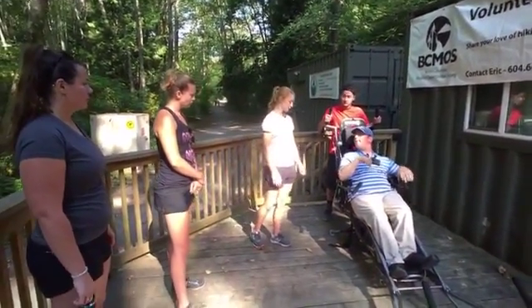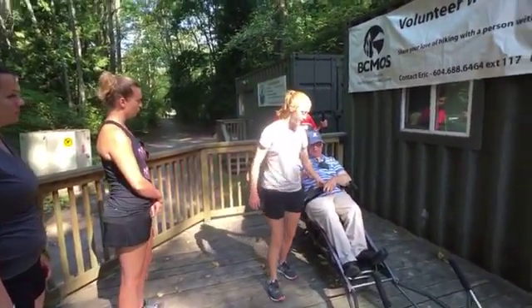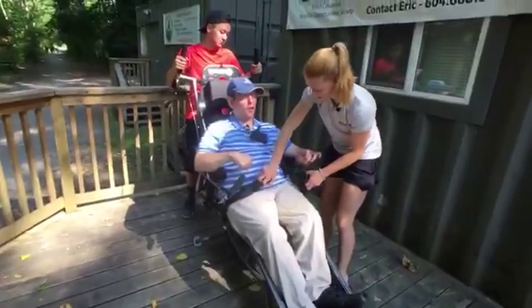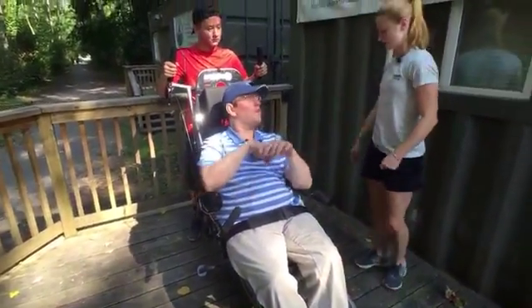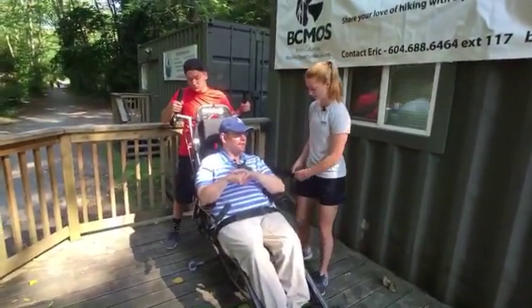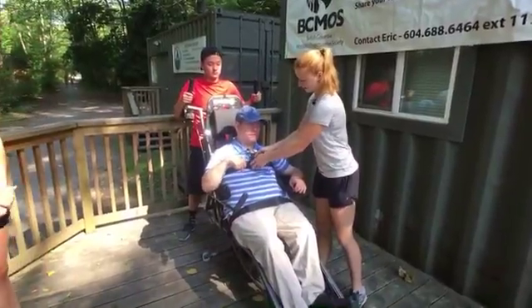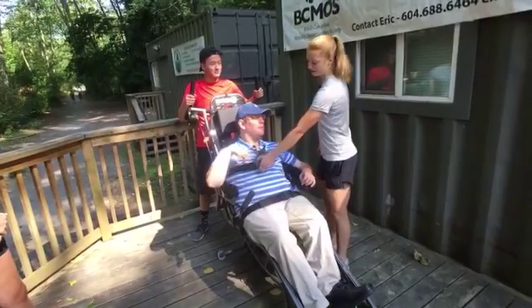All right, so the last thing we're gonna do, Eric, is we're gonna actually put these seatbelts on. There's 2 seatbelts on the Trailrider, one around the waist, and then there's also a chest strap as well, which Eric probably won't use, but... I'll go for the waist one. Okay. So we've got the waist one on. But you can just show how the chest one goes in case anybody's curious. Okay, and so this one goes right under armpits there. Thanks, Aaron. Just like that. So that's another option as well.